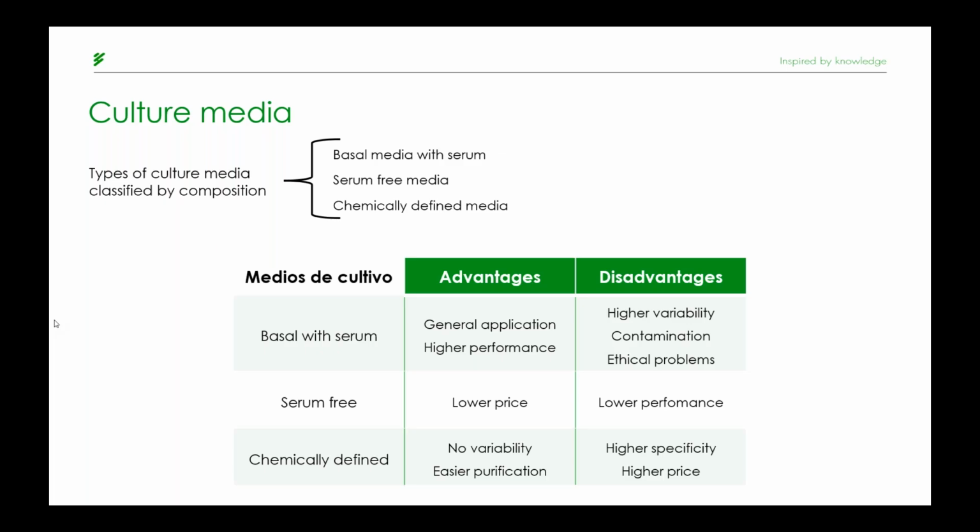But the main problem with this kind of media is that it has a high specificity for the cell line and for the product you want to produce. You can't use a chemically defined media for different processes or different cells, and it usually has a higher price. Also, the chemically defined media usually need more supplements than the serum-free media.